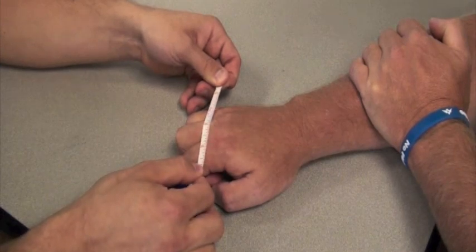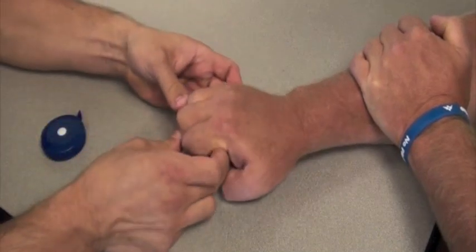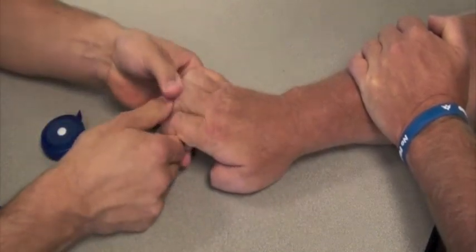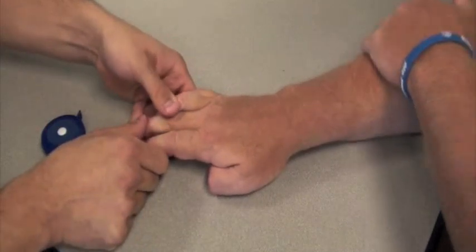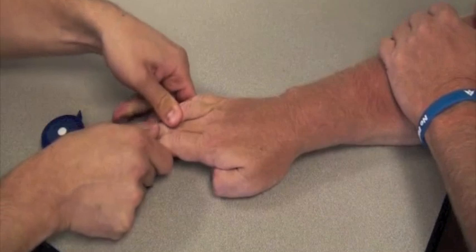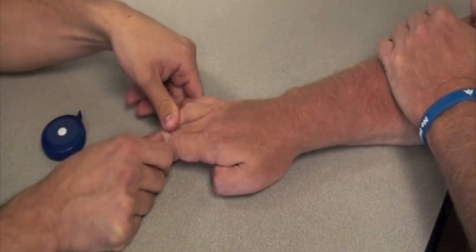If your measurement is on the border between two different sizes, assess the length of the fingers before selecting the appropriate size device. For example, if the fingers are long and lean, you may want to select a larger size device. Conversely, if the fingers are short and wide, you may want to select a smaller size device.